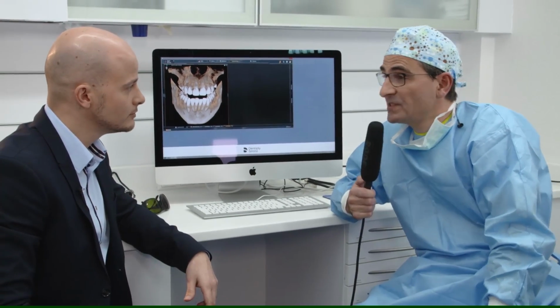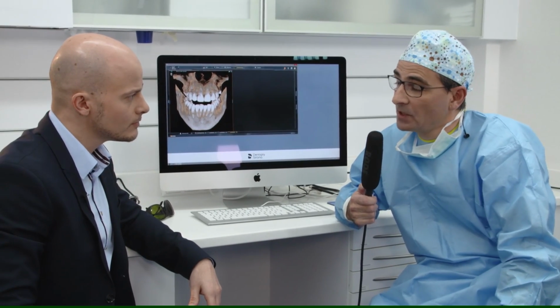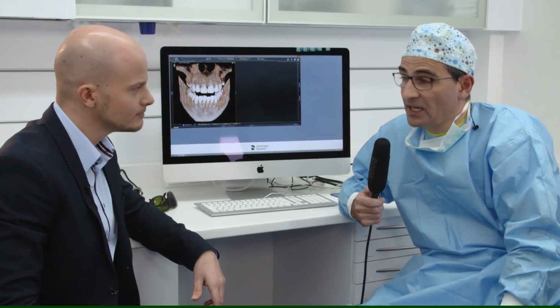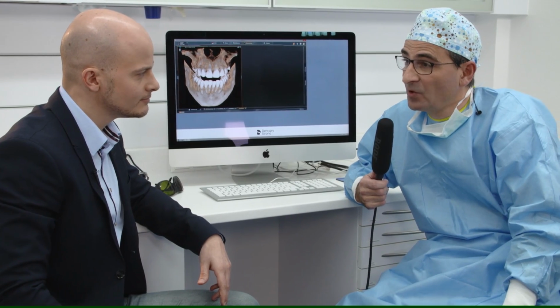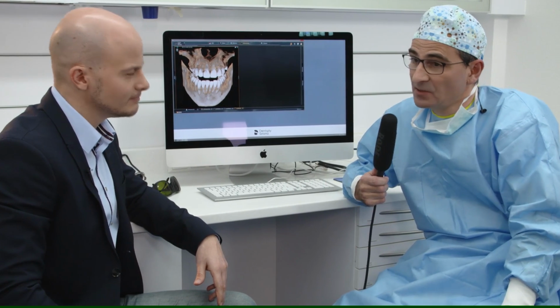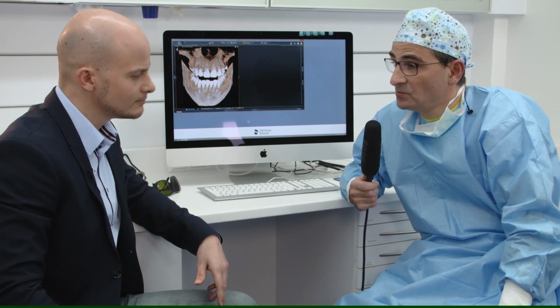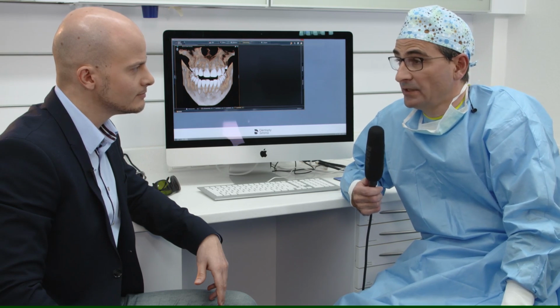Yeah, probably it was an easy surgery, but not because of the augmentation, because this was not an augmentation that we have done. And I recognized, as you could see, that the primary stability of the 4.5 implant was not such that I would prefer to make a gingiva former or something like this. So I decided to close it here.